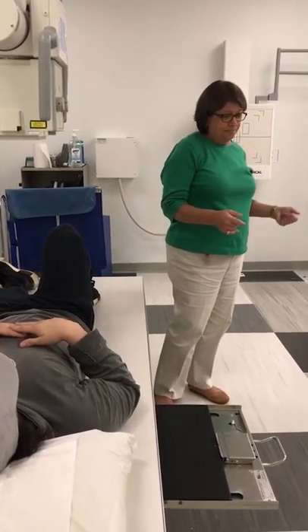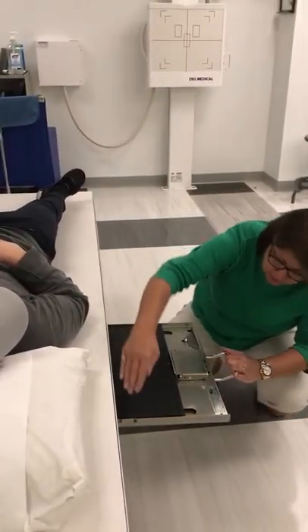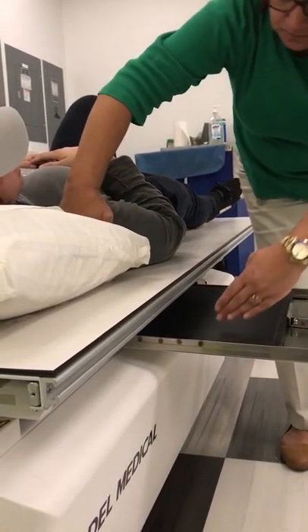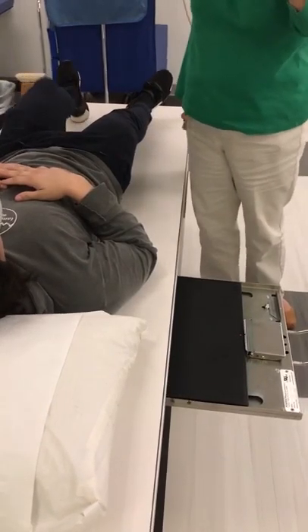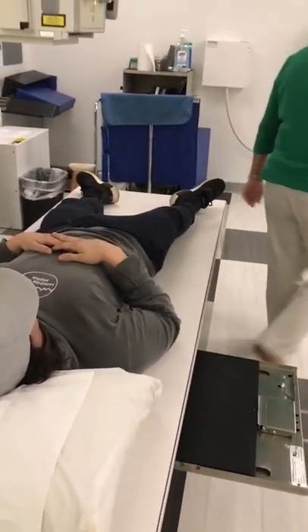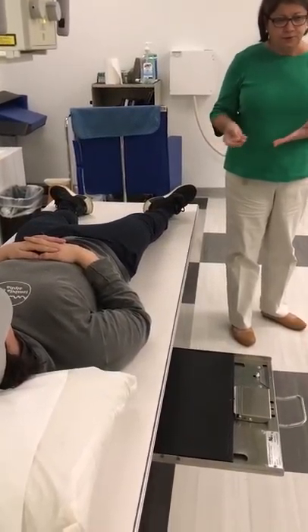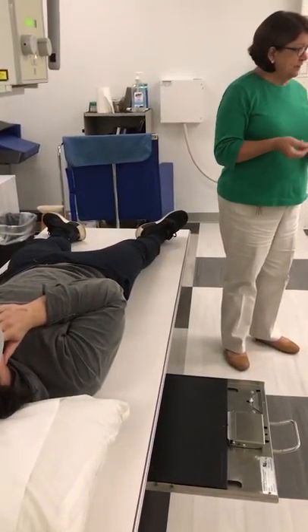But here's the trick. If you start out with the top of your IR approximately 2 inches above the shoulders, and then you center your tube to your bucky, you'll be centered at T6. So you want to do that before you close the bucky tray. The other thing that you'll want to do before you close the bucky tray and start positioning and centering is place your marker on the IR.